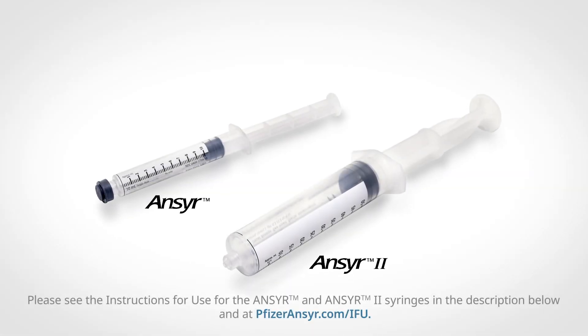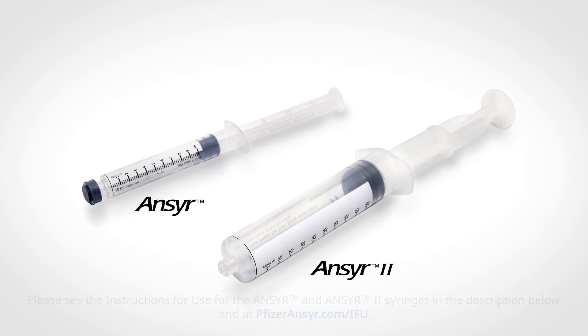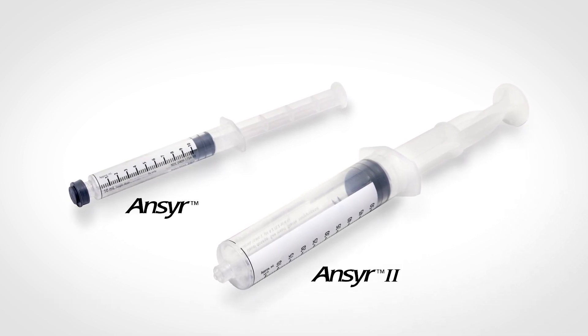The Answer and Answer 2 syringes are ready-to-use emergency syringes that may help to reduce the risk of medication errors and protect both healthcare professionals and patients.